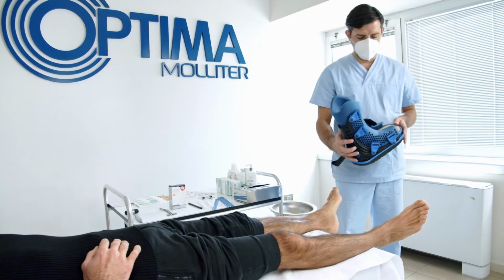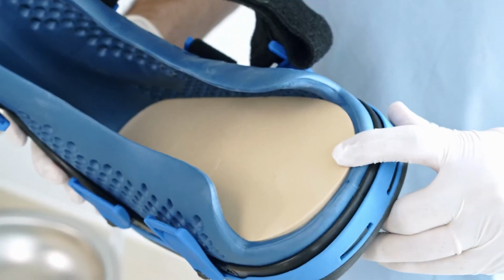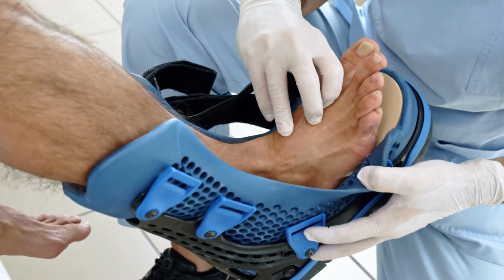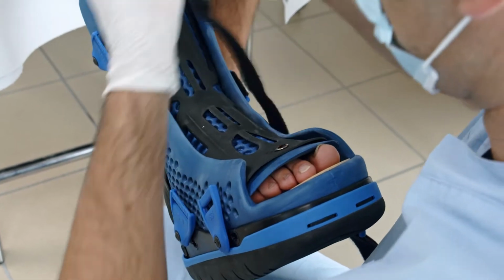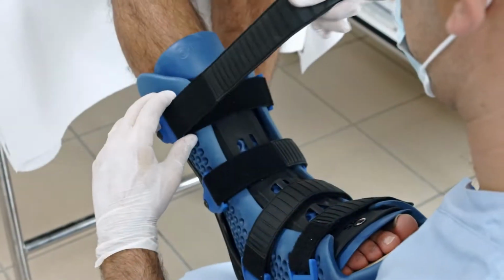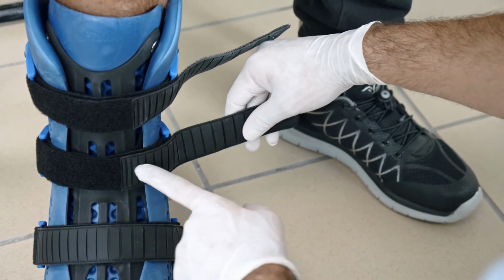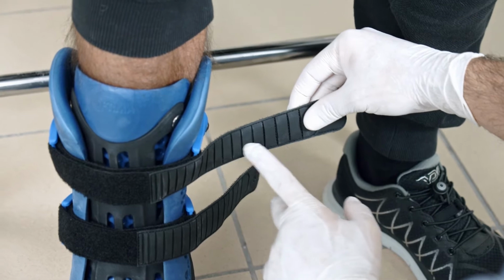We apply an SBI Motus Walker device to the patient, equipped with a fully rocking sole, ideal for the management of plantar ulceration. We place the foot inside the brace, making sure to bring the heel into contact first and then the forefoot. Then we fasten the velcro straps to secure the device to the leg. At this moment, the leg is not protected by a bandage, therefore the straps will appear much longer than they should. It will be possible to cut them to the appropriate size after applying the dressing.